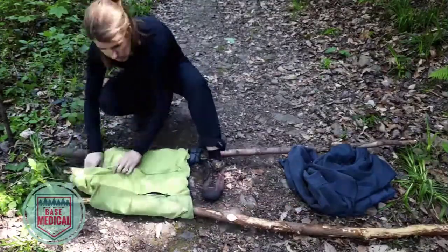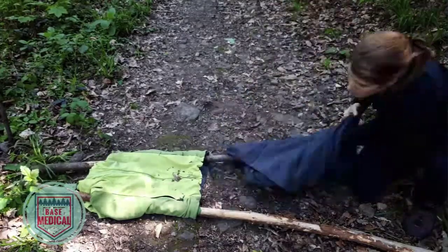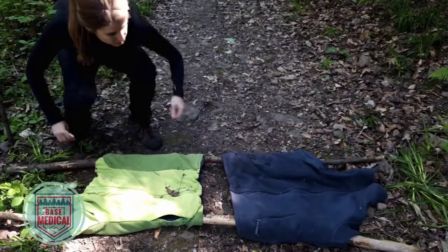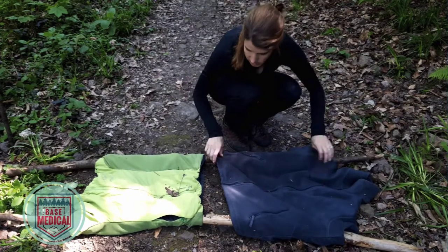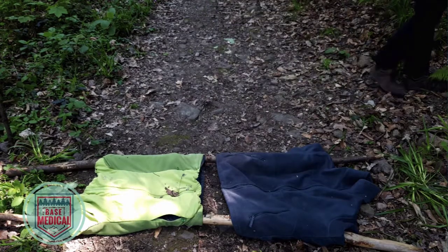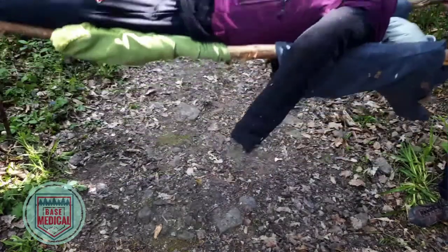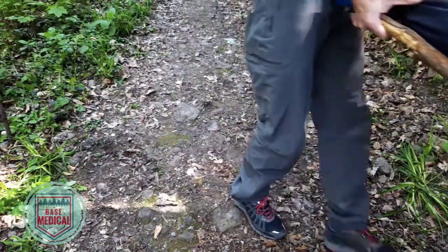Overall, this jacket stretcher did not take too long to make. It is not complicated and is good in strength and durability, especially if cross supports are added. However, more than two jackets are needed to make this a good stretcher, and using your jackets means they are not available to you or the patient to stay warm. Remember, the cold makes a shock or trauma patient worse.